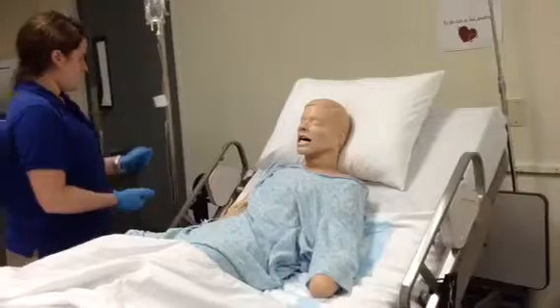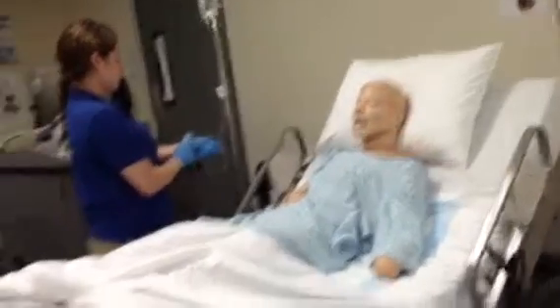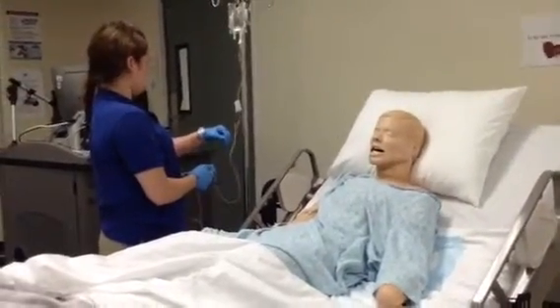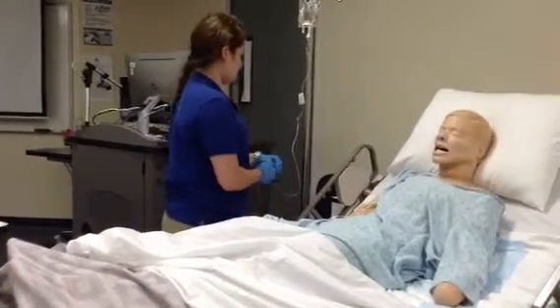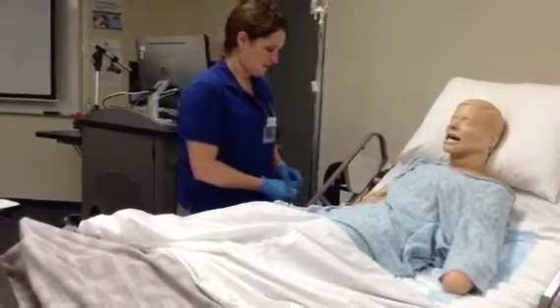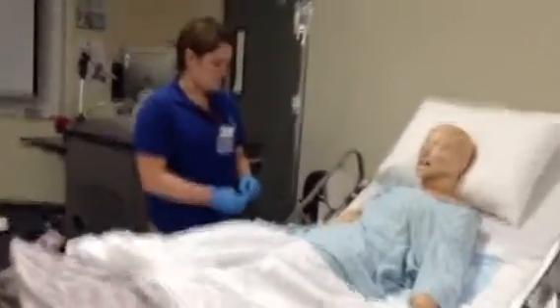And I'm going to set my flow rate to 17 drops a minute. Make sure he's flowing good. So his flow rate is at 17 drops a minute. And I'm going to check his site again, make sure it's in there. Make sure there's no phlebitis, no infiltration.